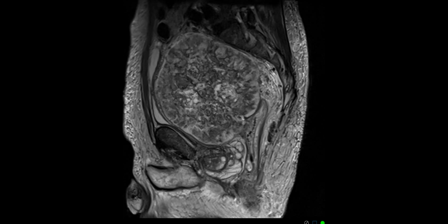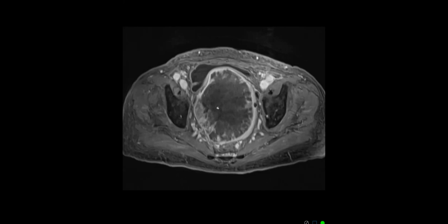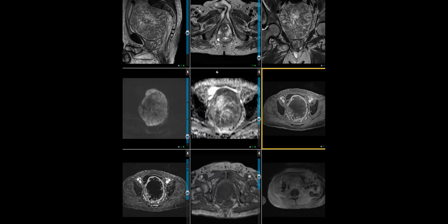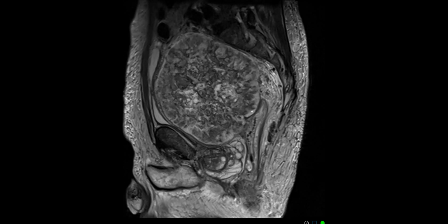neoplasm. So they biopsied it initially, and since, as we can see, there is so much non-enhancing area, it came out to be an inadequate sample, some necrosis or something. And since the patient was not willing to undergo surgery, the thought process was if it is GIST, then it is so amenable to treatment with Gleevec or imatinib. So they re-biopsied the lesion from the transrectal approach, since here we could see this. Probably the second time they got a better specimen, and the final diagnosis from pathology was malignant spindle cell neoplasm. It was positive for SMA, which is smooth muscle actin, but negative for CD117.